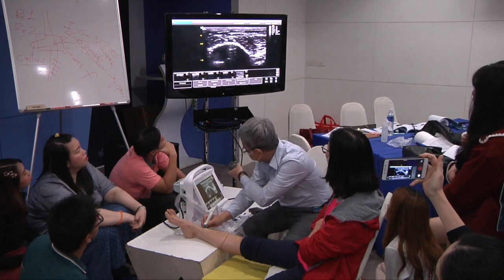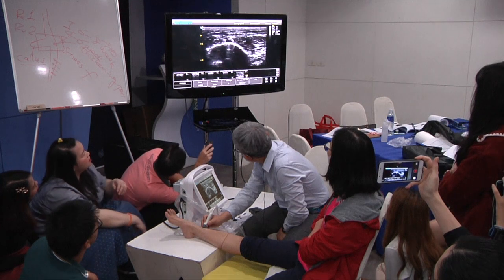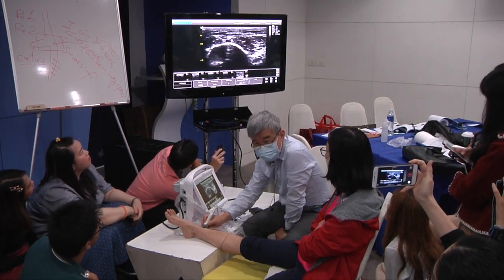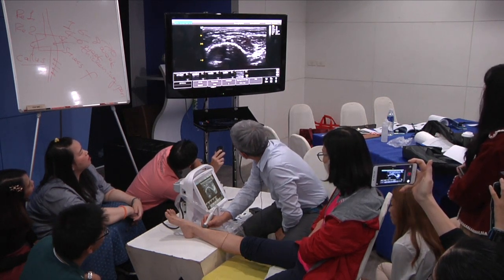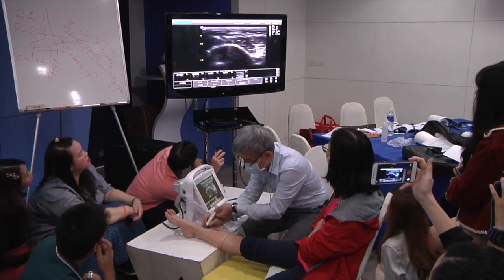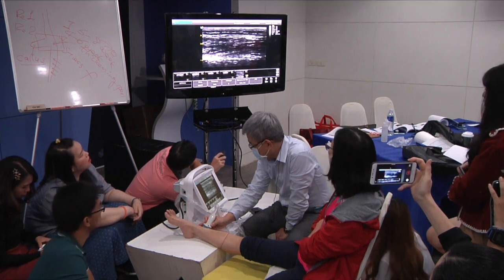Okay. Pimon, can you help me? In the middle, yeah, under. Because the range of my cervical spine is not good enough to turn over 90 degrees. Yeah, thank you, thank you. Higher. Yes, this one. Okay. Then we turn 90 degrees. Okay, this is the tendon of extensor hallucis longus. Good. Then with muscle fibers.